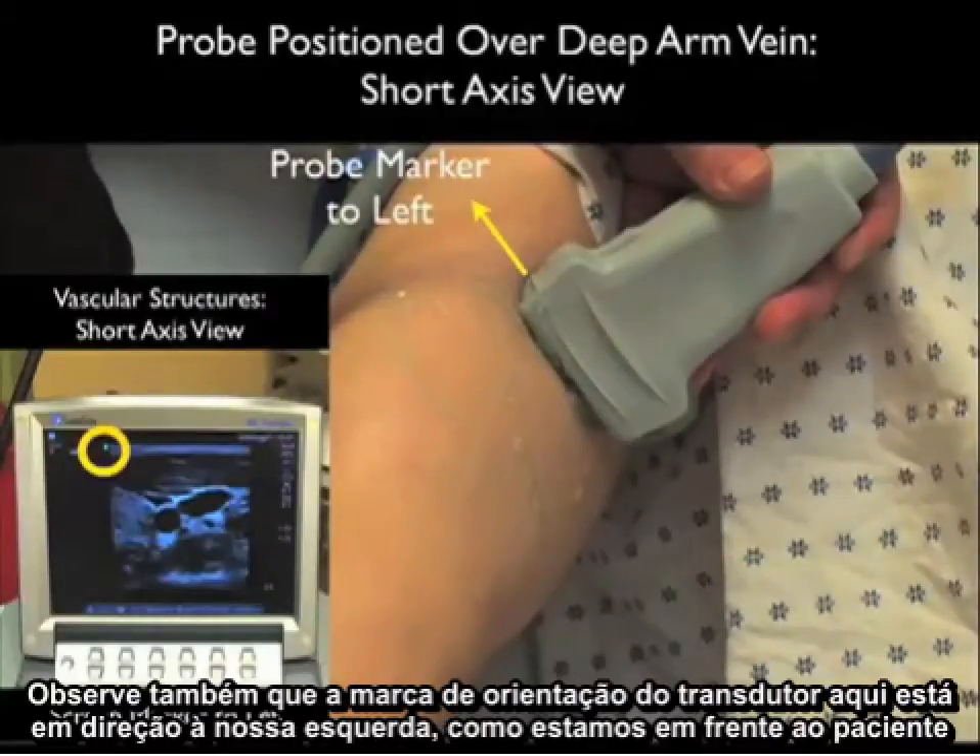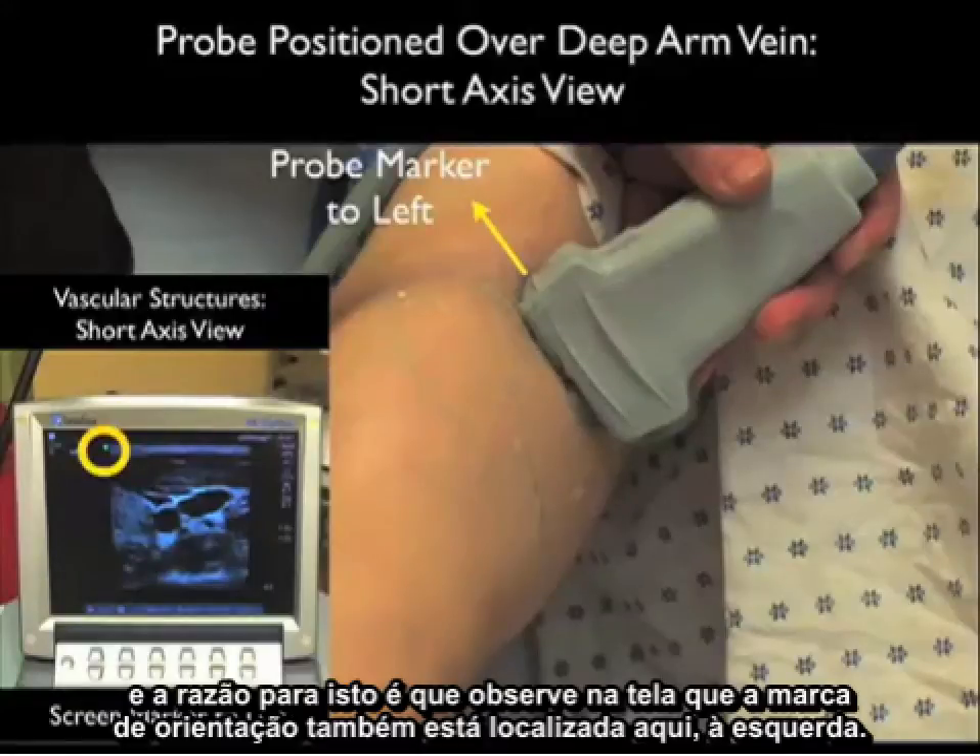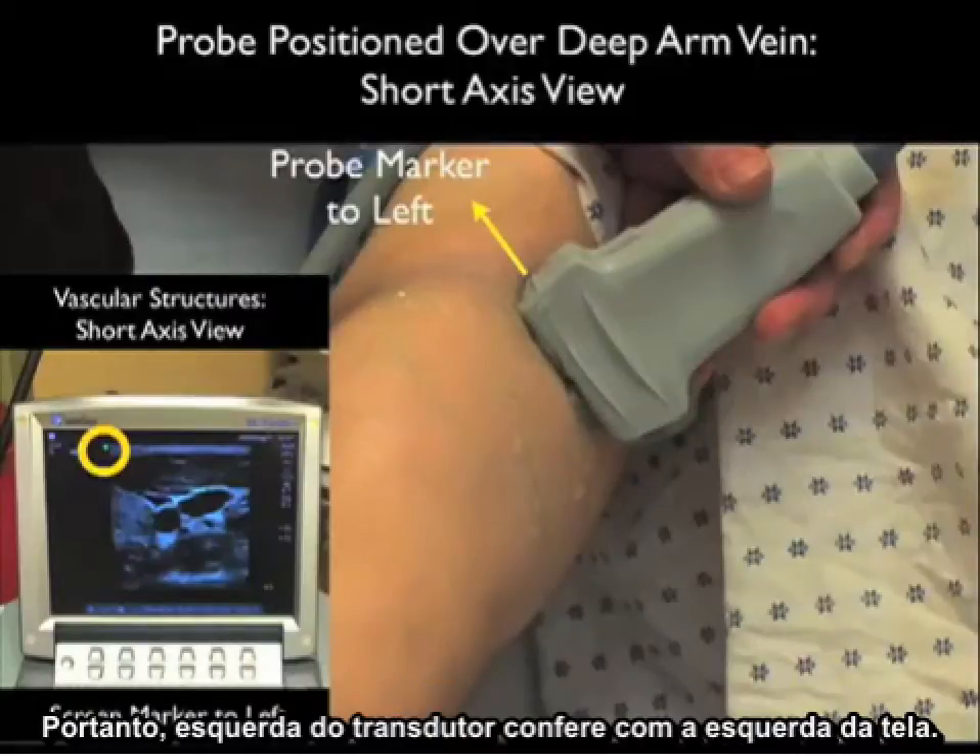Notice that the probe marker is towards our left as we stand in front of the patient. The reason for that is the indicator dot on the screen is also located to the left — so left on the probe lines up with left on the screen.